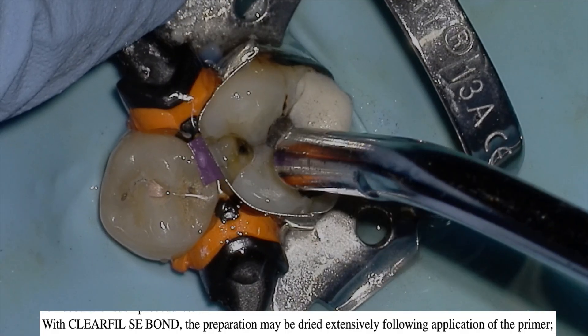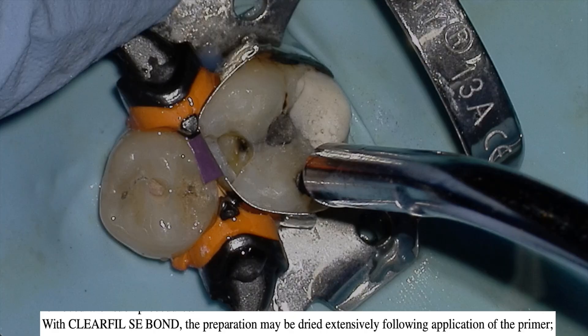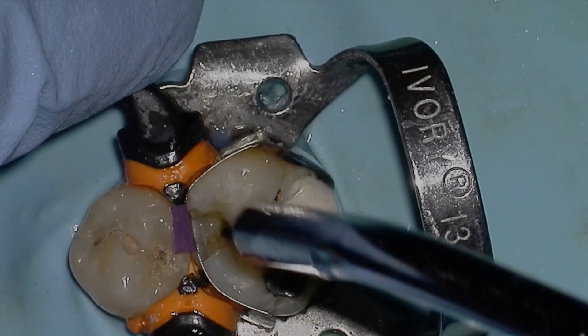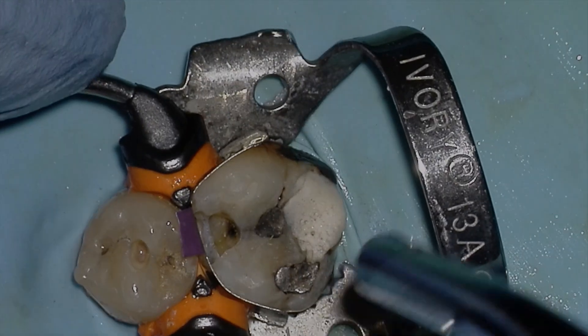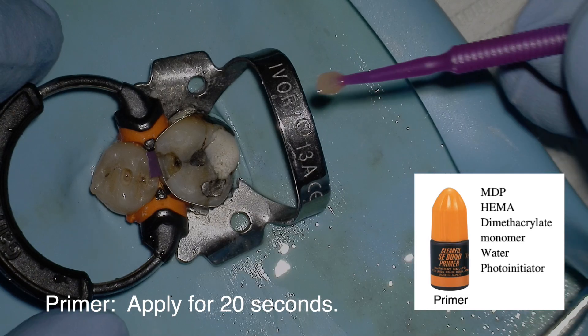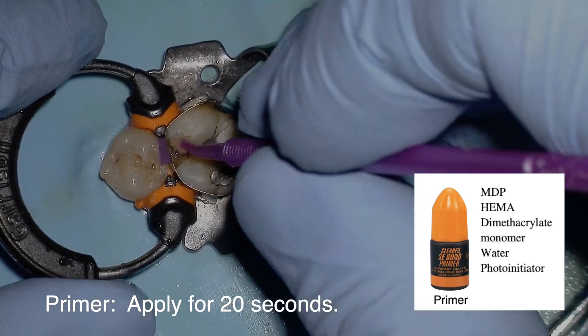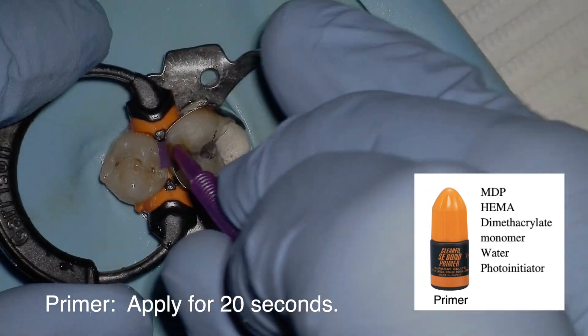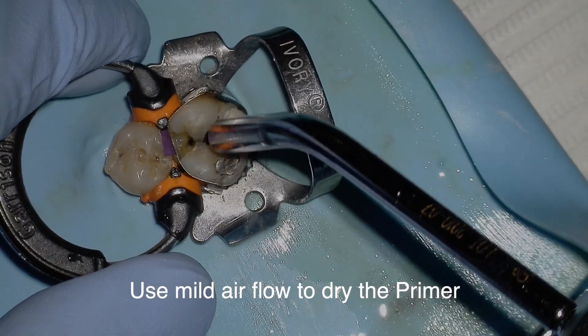As per the manufacturer's instructions for ClearFil SE, the preparation may be dried extensively following primer application — as compared to the wet bonding technique used with most other bonding systems. Apply the primer for 20 seconds; you can either scrub it in or just leave it. Scrubbing increases the probability of full coverage. Then use mild airflow to dry the primer.